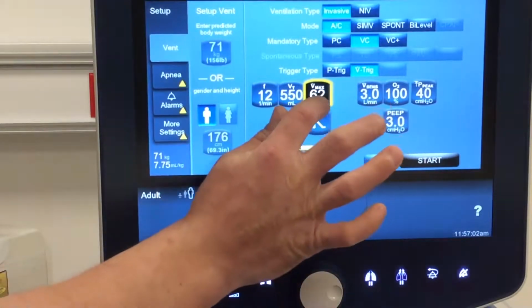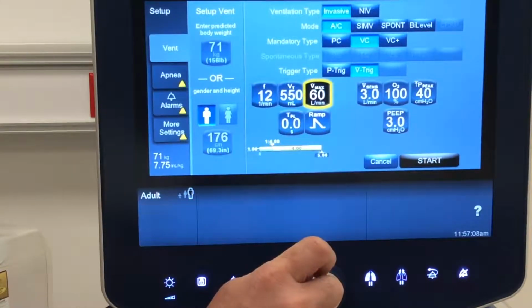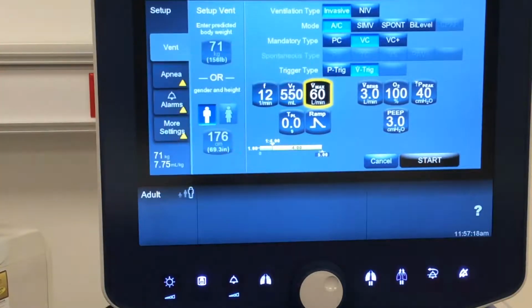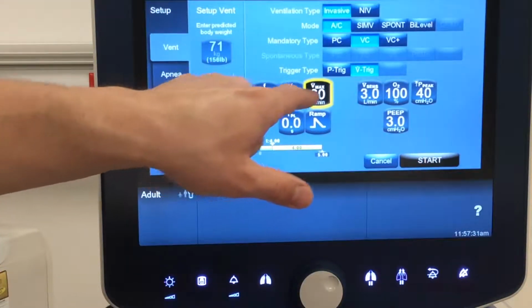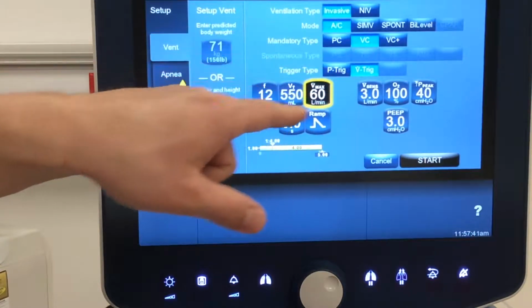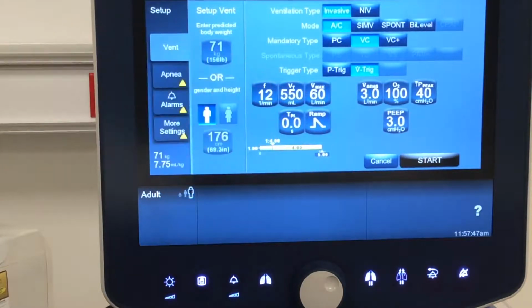So essentially, we're telling the ventilator to kick out 60 liters per minute. We're going to talk about what this is here in a second. We're telling the ventilator to kick out 60 liters a minute until it delivers 550 mils. If I had a professional cameraman here, I'd draw you an equation on the board, but it's something we're going to talk about in lecture quite a bit, and I have it drawn out. But essentially, inspiratory time is the relationship of your set tidal volume, so our goal amount of flow delivery to the patient, which is a volume in essence, so 550. It's tidal volume over your flow rate. So this is the speed at which we're trying to attain and deliver 550 mils.